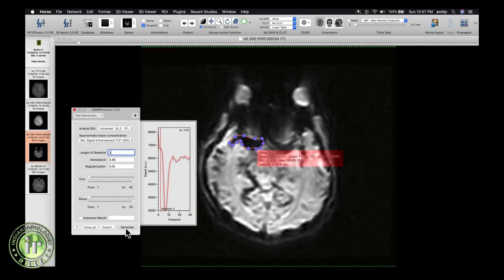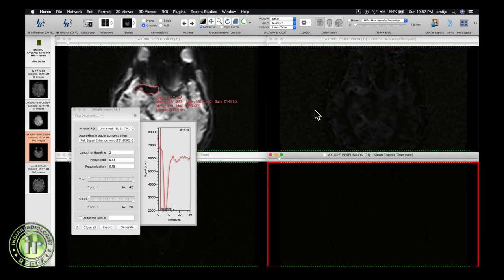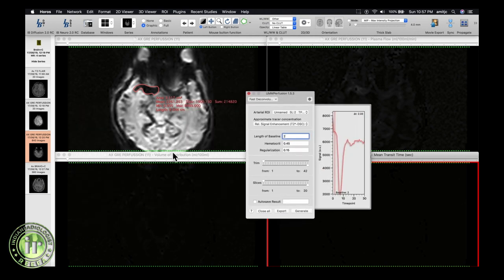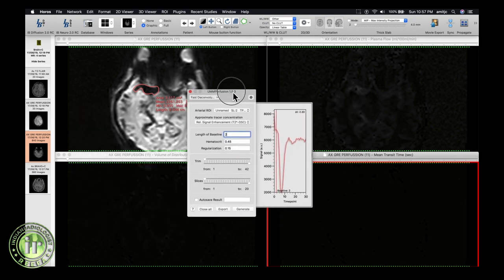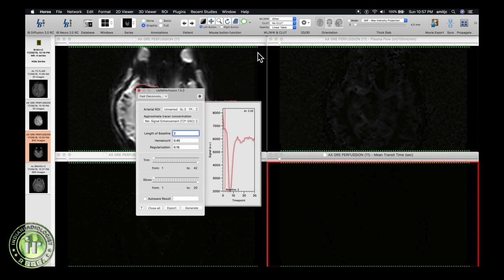Then hit generate. This will create the various perfusion maps: plasma flow (which is cerebral blood flow), volume distribution (cerebral blood volume), and MTT (mean transit time). For tumor imaging, predominantly cerebral blood volume is utilized, so I'll turn off the other two generated maps.